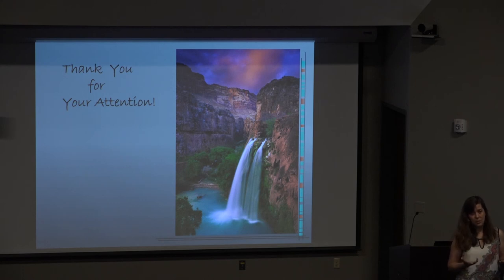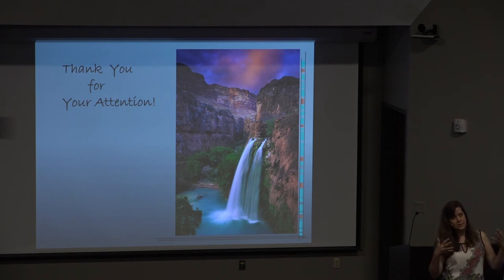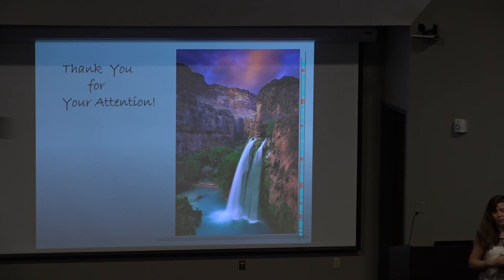And what we're looking for is a lot of heterogeneity of placenta. When I say that, instead of the placenta being like a nice light gray everywhere, it's got a lot of black lines in it, and instead of being nice and smooth, it's got like zigzag or lobules along the end. And so that's basically what we're looking for. And I think that correlates to the ultrasound, where you guys see a lot of vascularity in areas where there is potentially increta and percreta. So those vessels are the black lines that we're seeing on our MR. So when we see a lot of that, then we're worried.